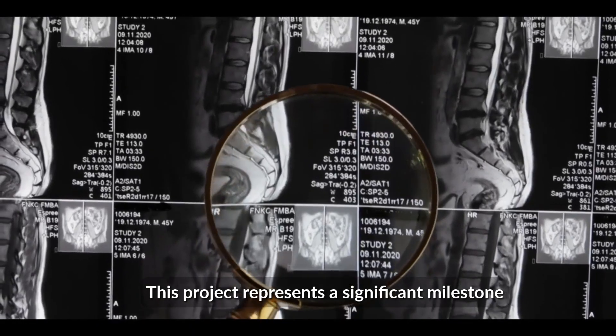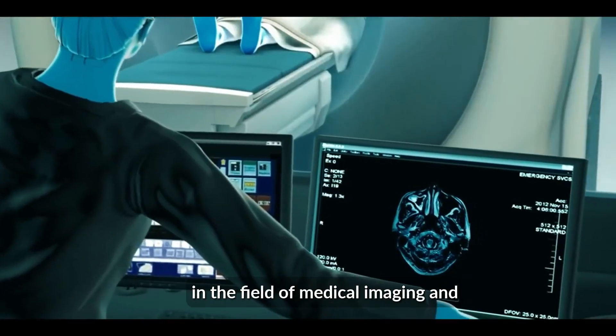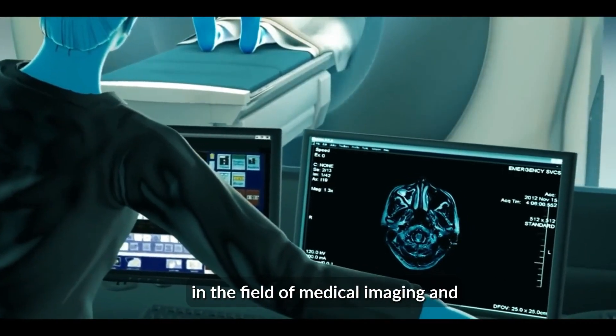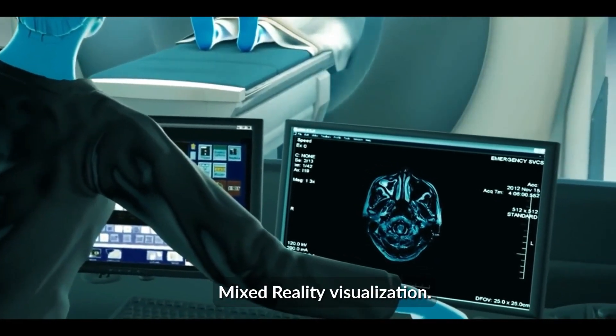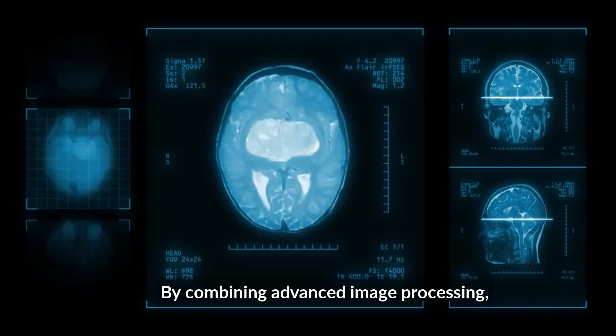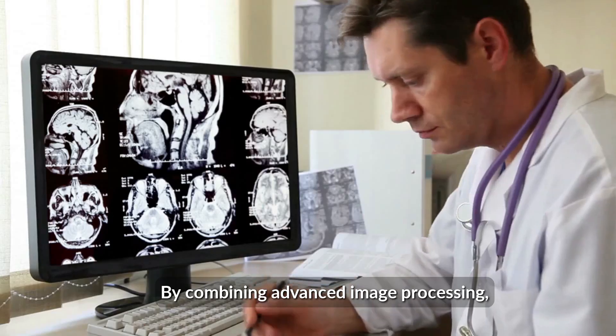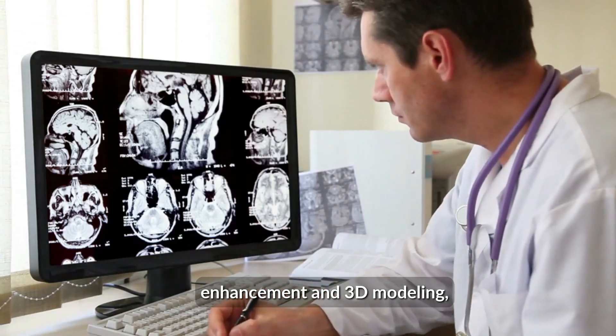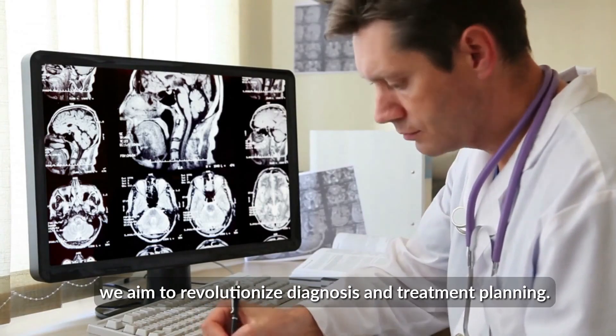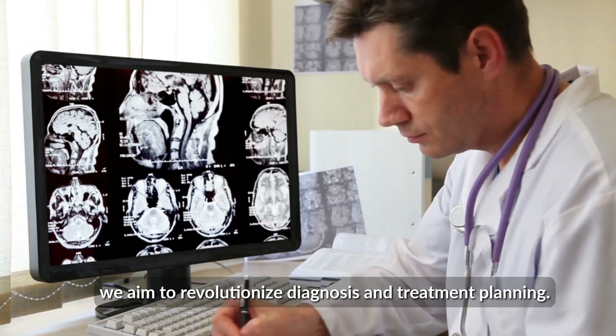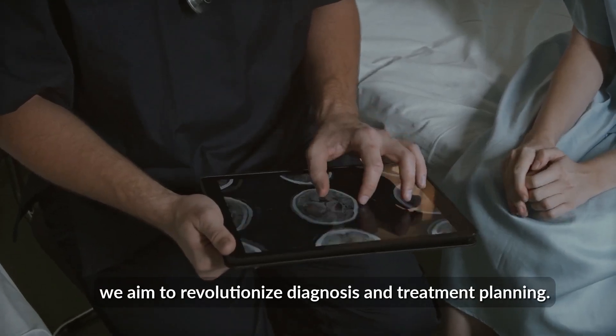This project represents a significant milestone in the field of medical imaging and mixed-reality visualization. By combining advanced image processing, enhancement, and 3D modeling, we aim to revolutionize diagnosis and treatment planning.